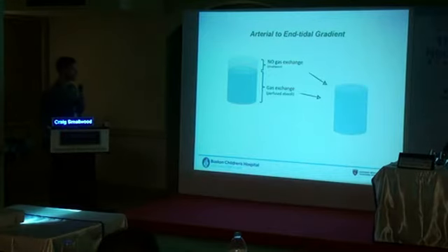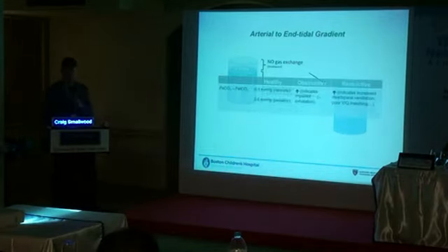There we go. And there's supposed to be a little bit of a difference between these colors, but you can't really see. But you average those out and you get something that's about 35 millimeters mercury. That's why we get the difference. So here's the important piece.